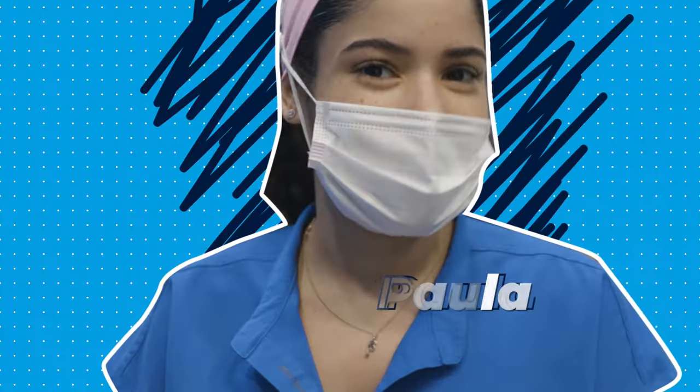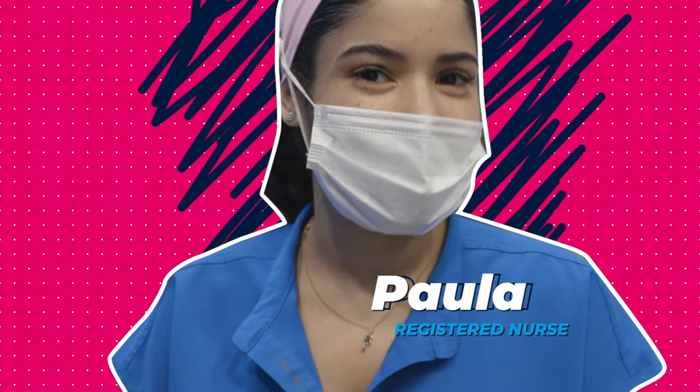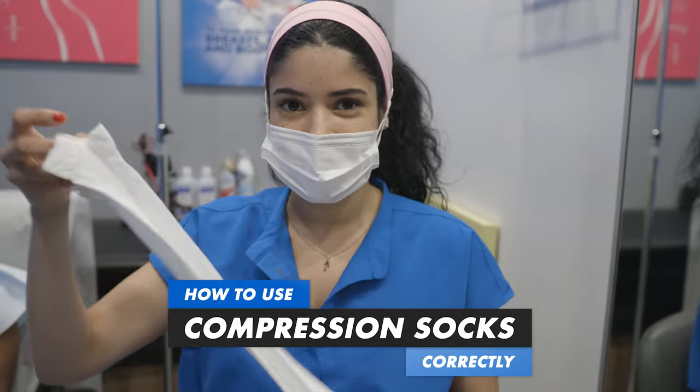Hey guys, my name is Paula, Dr. Williams registered nurse. Today we're going to be talking about how to put on compression socks correctly.